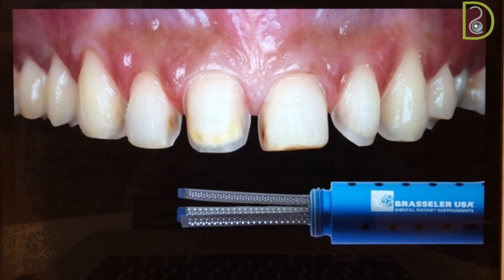So halfway through the contacts, if good color and contour is available, what if not? Just to make sure the impression material will flow in between the teeth. And also the technician, once the case is poured, has to be able to section the dies and open the contact.